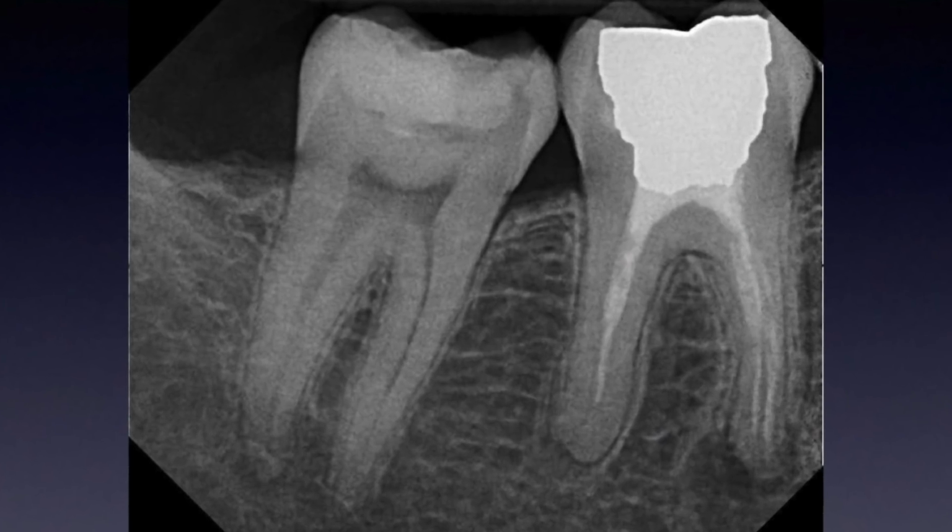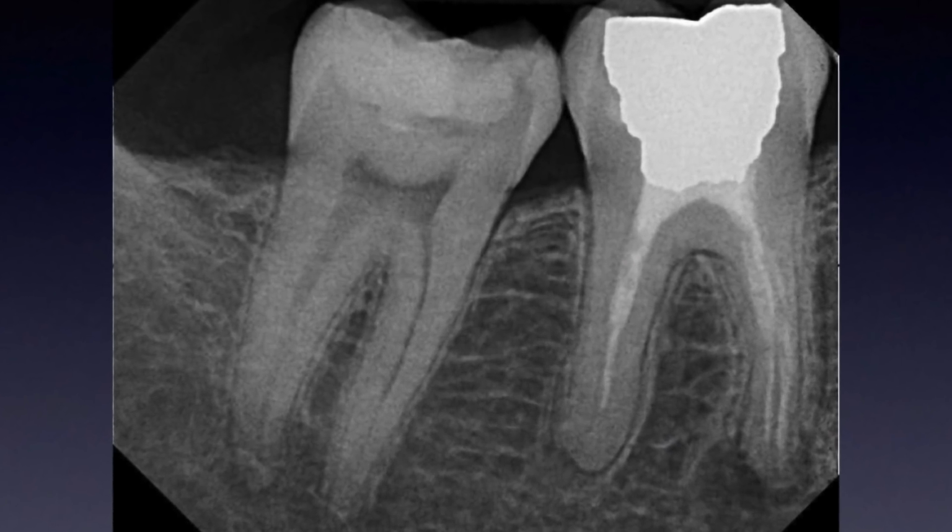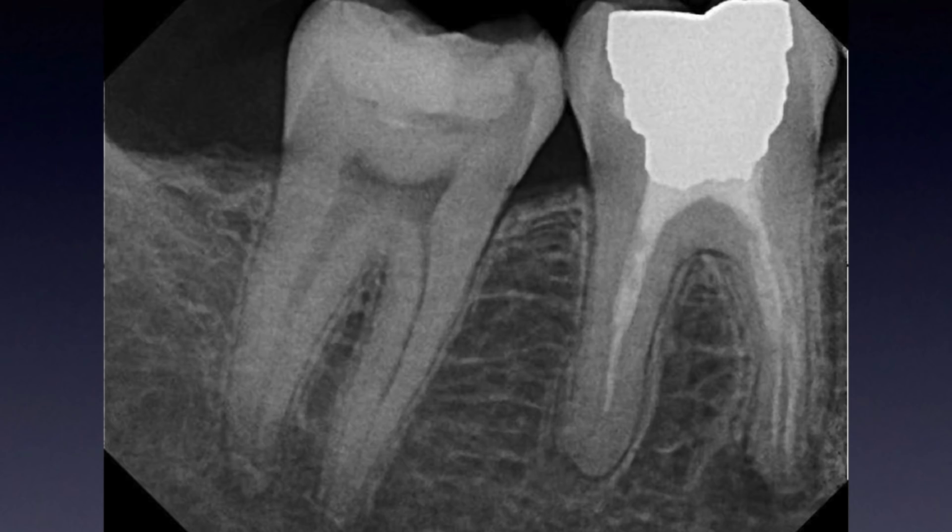So let's get back to the question I asked about the x-ray. What's the problem? Well, that's actually a really trick question, because when it comes to diagnosis, a radiograph alone is not diagnostic. It's really nothing more than one piece of the puzzle.